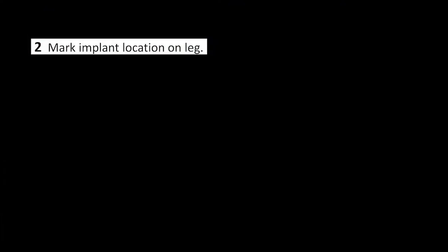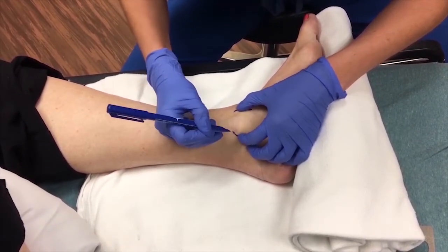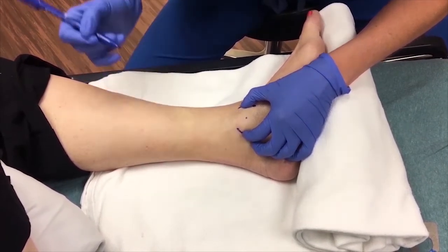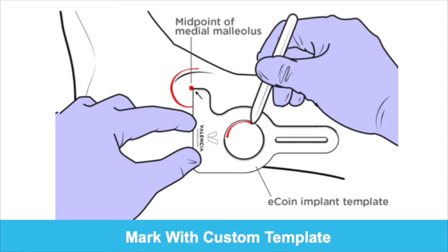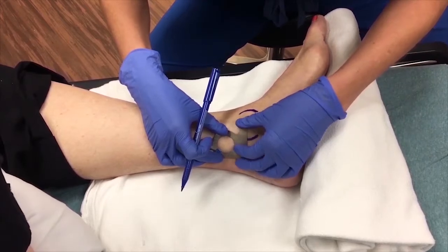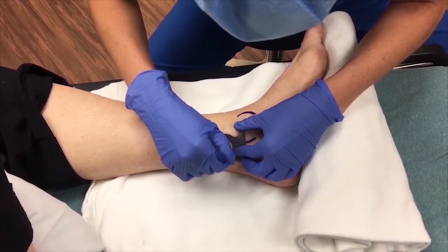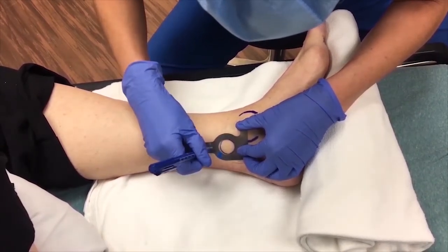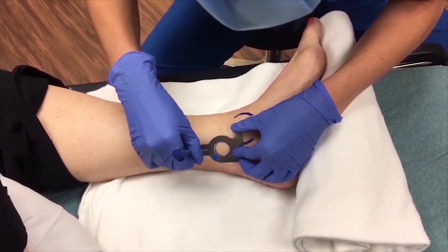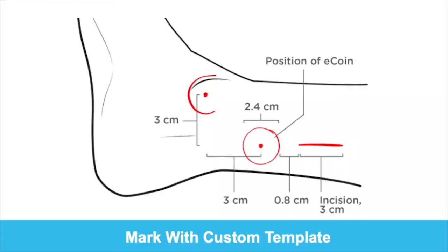Step 2: Mark Implant Location on Leg. Palpate, then mark the anterior and posterior borders of the medial malleolus, then mark the midpoint. Place the template in position and use a marking pen to draw a circle along the inner edge of the large opening — this circle indicates the surface projection of the ECOIN device position. Next, mark a straight line through the narrow slot; this line indicates the planned incision. A summary of the markings is shown on this diagram.